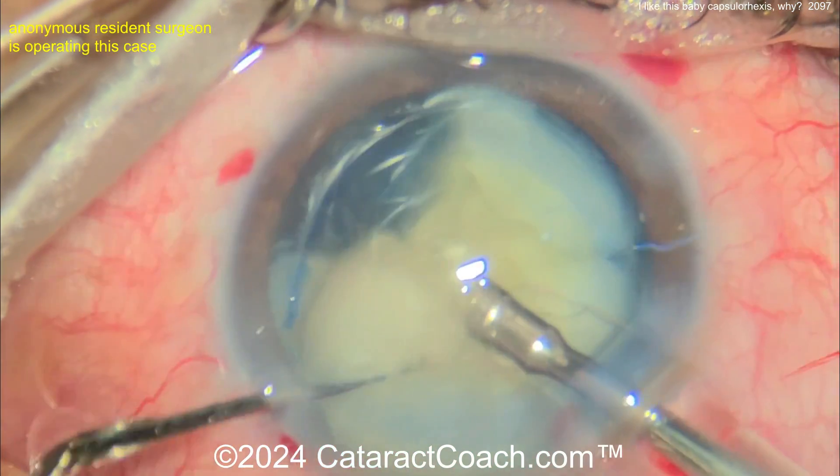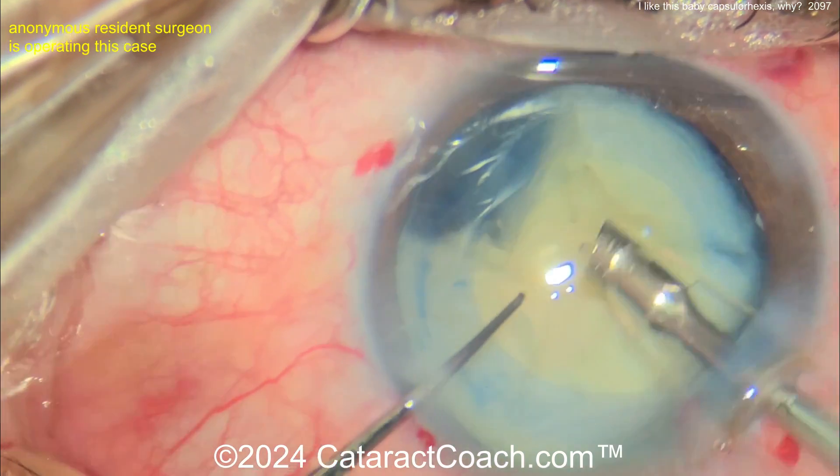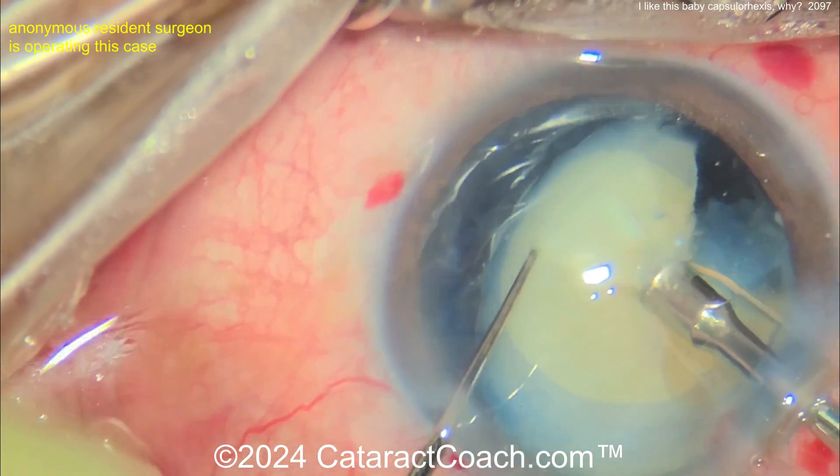Taking this down — just be careful, that Sinski hook does have a sharp tip. Now rotating the nucleus. Very nice technique here. This surgeon has some good skills — if you're a resident doing this, that's fantastic.